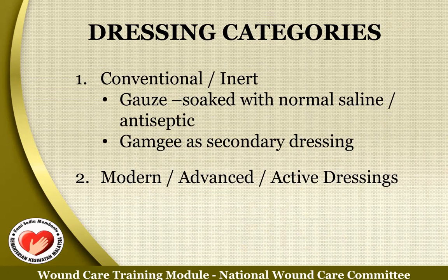There are two types of dressing category. First of all is conventional, and second, modern or advanced dressing. Conventional dressing will be using gauze, gamgee, soaked with normal saline, or any type of antiseptic solution. I'll be elaborating more on modern or advanced dressing.